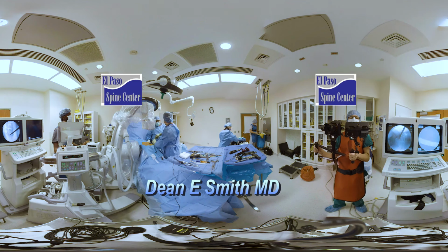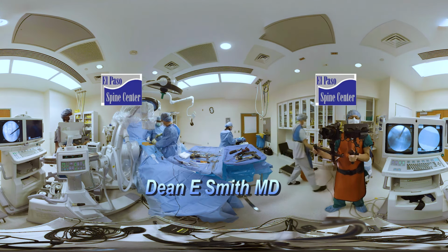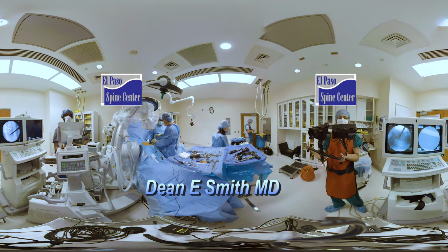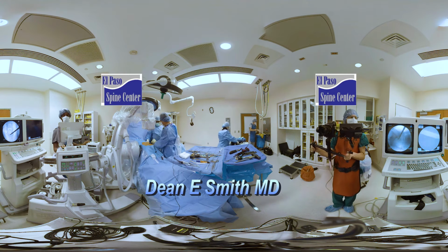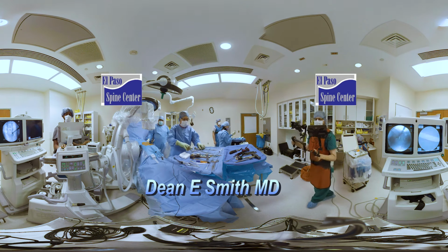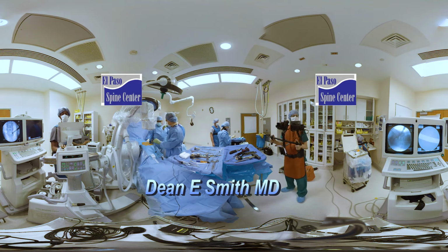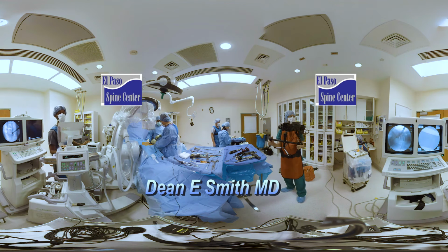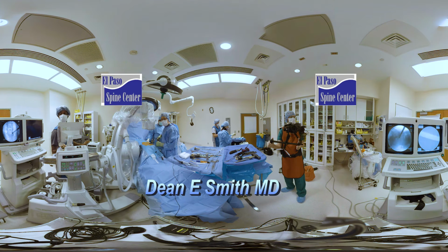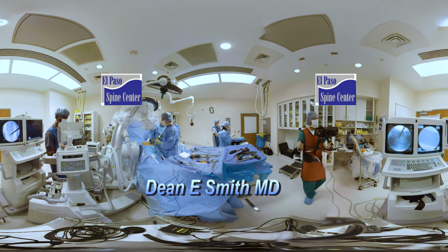So now we're just cleaning out the disc space. Exactly. Lateral, please. Okay, let's see. Take this out. AP, lateral, let's make sure we didn't move anything. And still looks good. Okay. Lateral, please. Yeah, that's a good flat. AP. Okay.